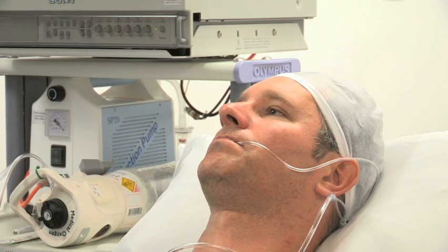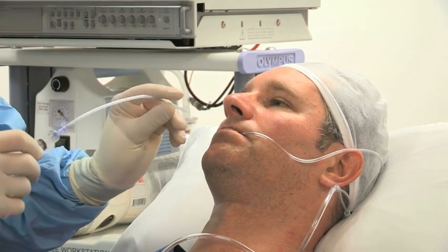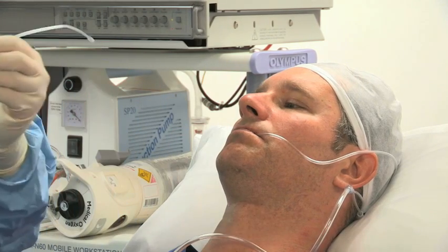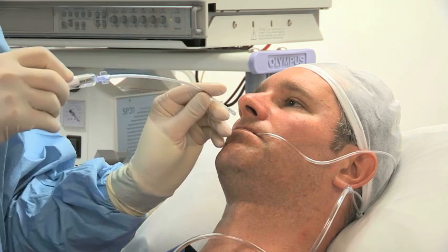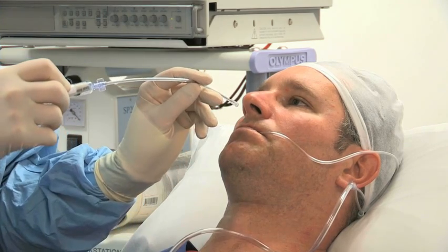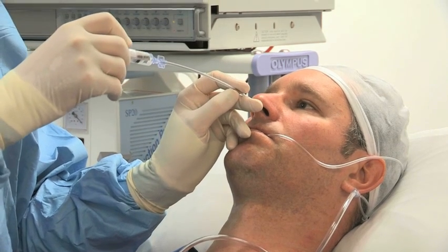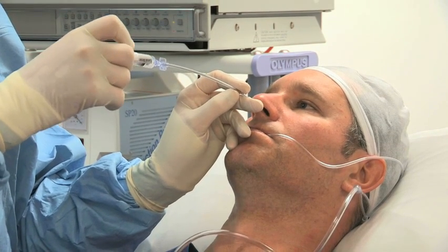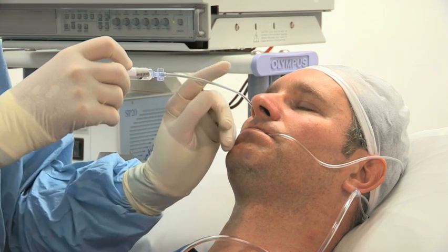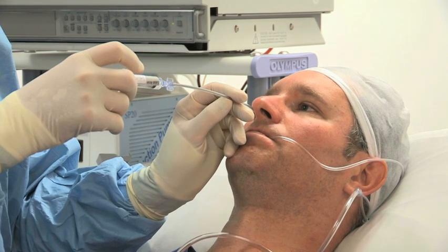The next step is administration of 4% lignocaine to the nose using a mucosal atomizer device attached to a syringe. When passing the endotracheal tube, a significant source of discomfort is at the nasal opening, so start spraying here. Ask the patient to sniff on spraying and use 0.5 millilitre aliquots whilst advancing the atomizer into the nose. Aim to use all the volume and finish at the back of the nasal cavity.